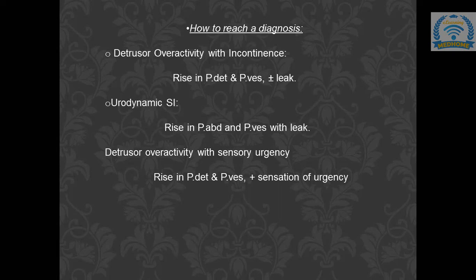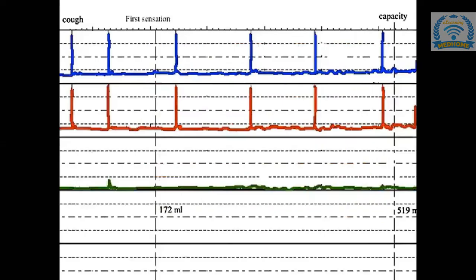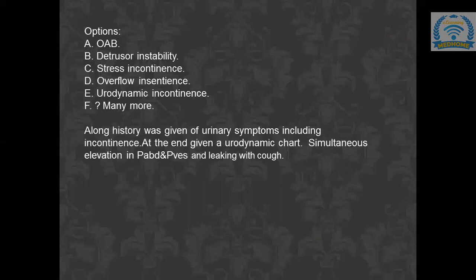Ma'am, the patient's symptom will be urgency? Yes, urgency, nocturia, frequency. And we will diagnose it on the basis of the graph only, on the basis of urodynamics. All clear? Yes, ma'am.